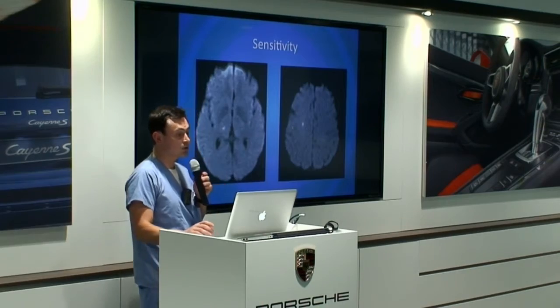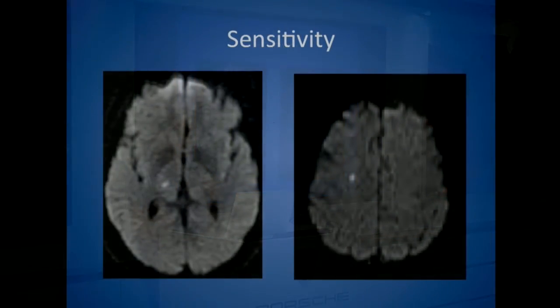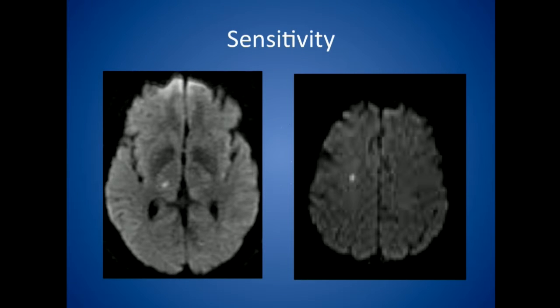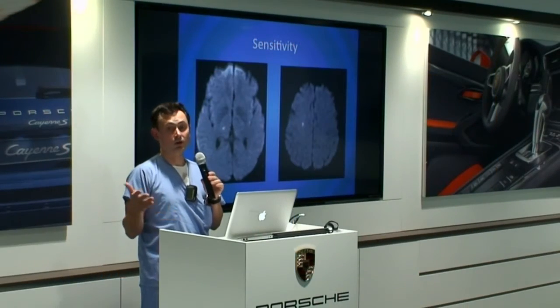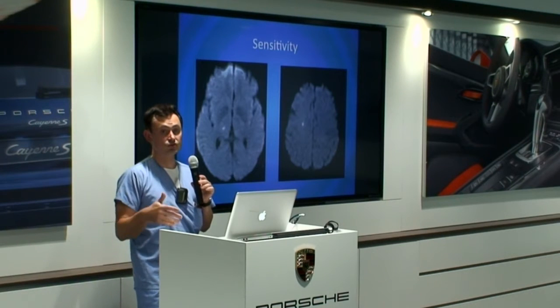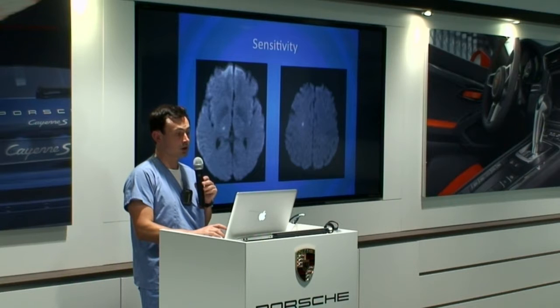And then the other thing is for stroke mimics. As I was saying, MRI is really good for these cases that present a dilemma. So for example, a patient who has a thalamic infarct, clinically, they could have very, very bizarre signs, and you don't really know what's going on. Are they making it up? Are they seizing? Is there something else going on, some kind of viral infection? But an MRI will show you right away that there's a stroke here in the thalamus.